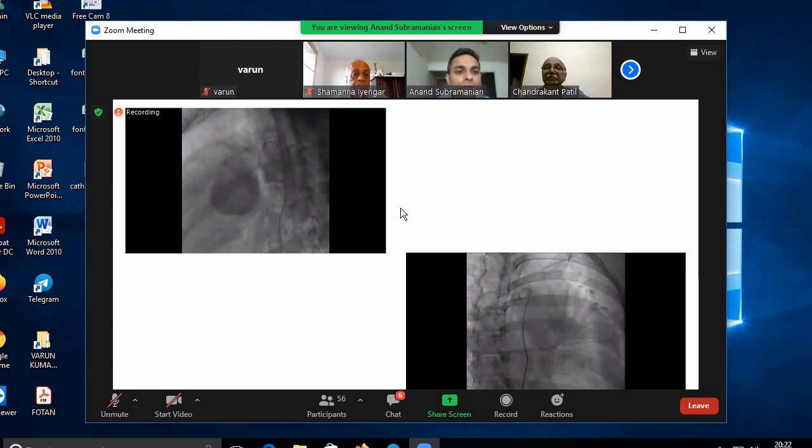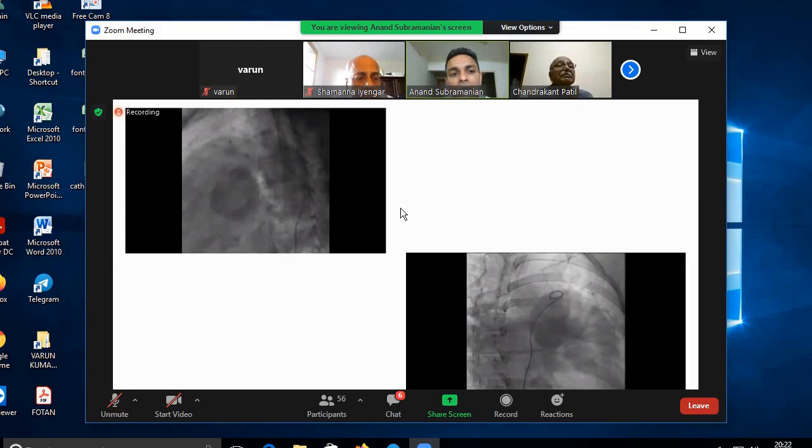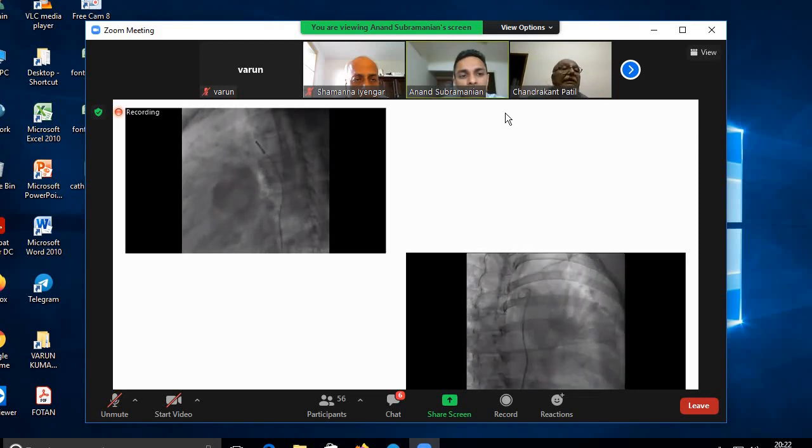So your diagnosis was right, and this was an angiogram which we did. So conventional views which we take are a left lateral angiogram. And in case we cannot see the PDA very well, then what we would do is take a right anterior oblique, say somewhere around an RAO 30 degree. RAO 30. So if you see here, in the first angiogram, you can see a large PDA.